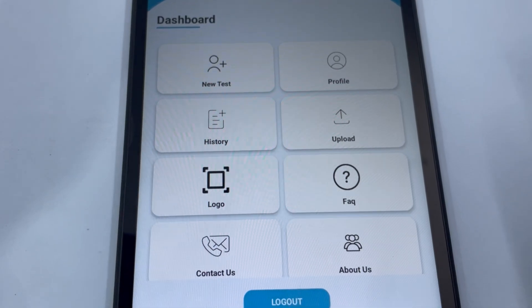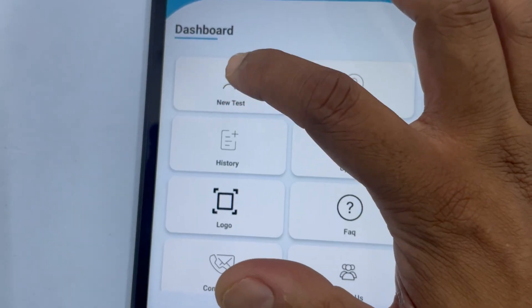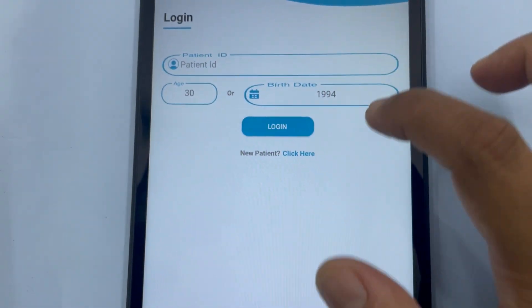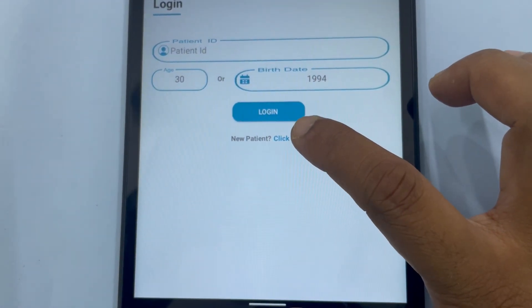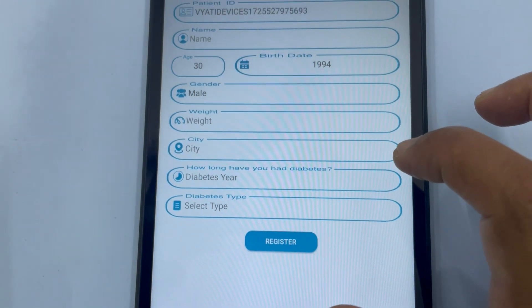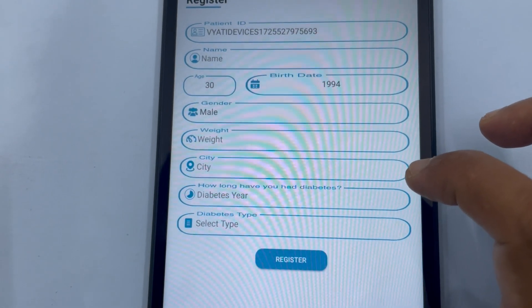Sensory testing. On the app dashboard, tap New Test. On the patient registration screen, click 'Click here for new patients.' Enter the patient's details and tap Register.